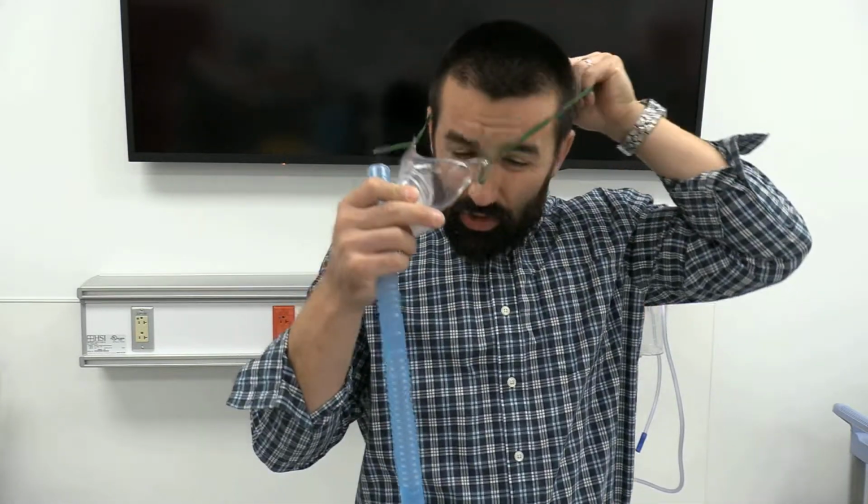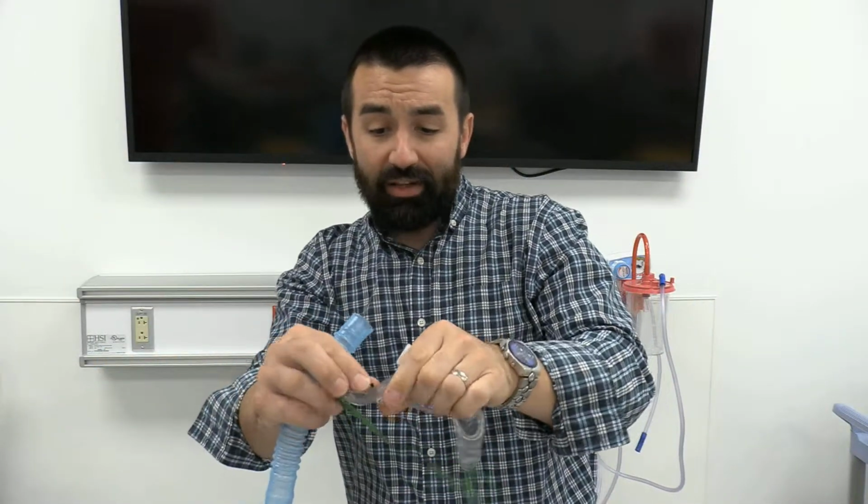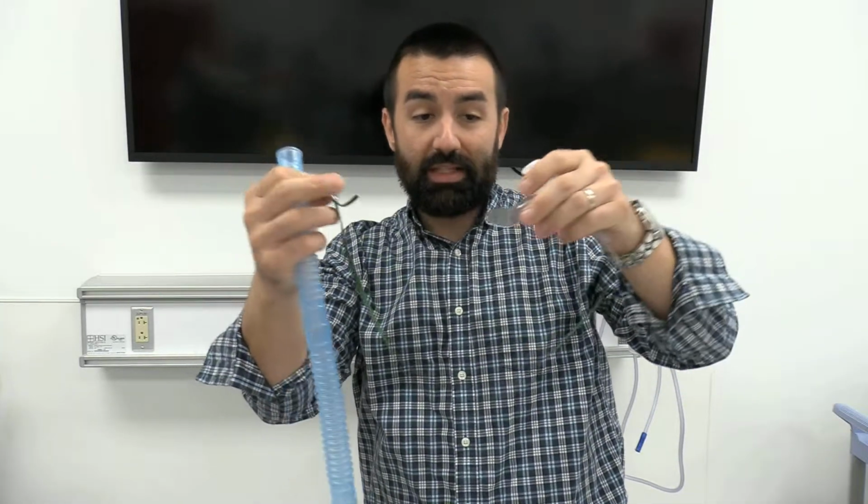People have put this trach collar on wrong, but really it's supposed to sit kind of the way the chest is. Sit right up over the trach, and kind of snug that up here. You do have a snap button since we're having to run this back behind somebody's head.